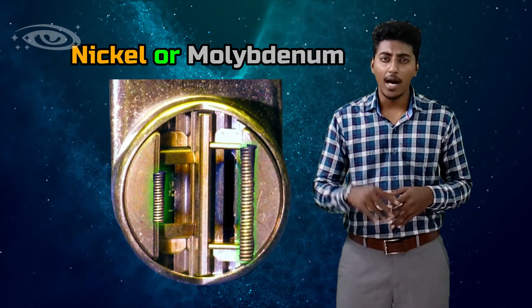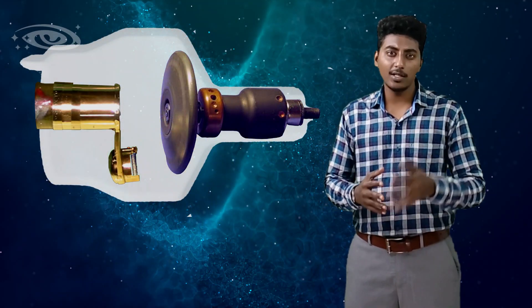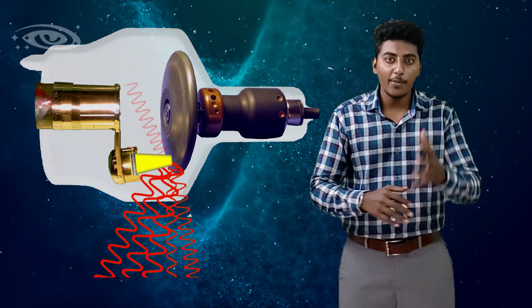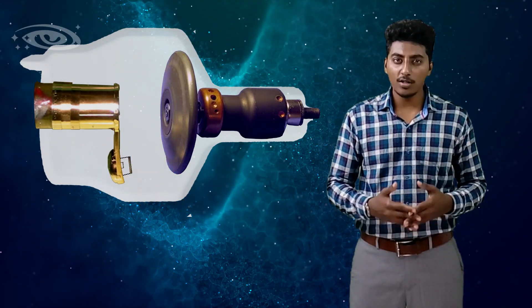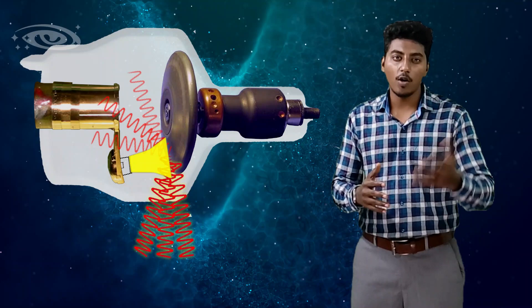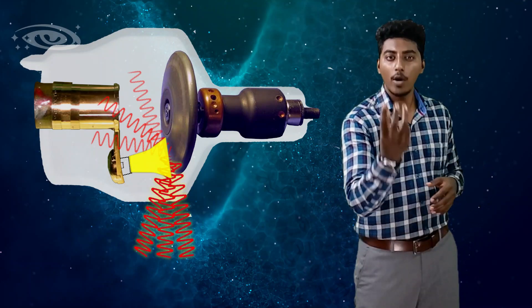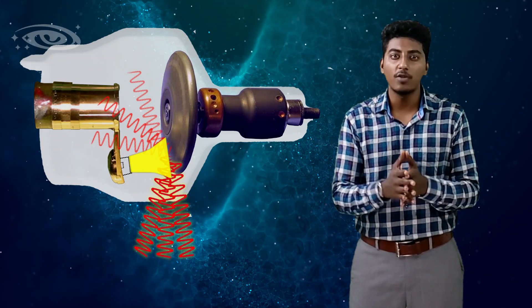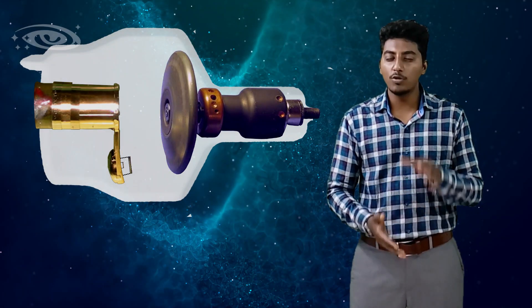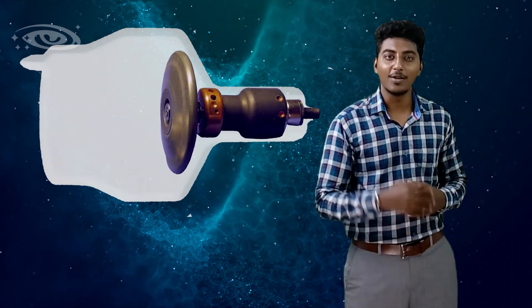The focusing cup is made up of nickel or molybdenum and the two filaments are embedded in the focusing cup. A separate high negative voltage is supplied to the focusing cup to converge the filament electrons to the focal spot of the target or anode. If there is no focusing cup, all filament electrons diverge and fall on the anode, so only a few X-rays will be produced and the rest of the electrons are wasted. To overcome this problem we use a focusing cup.